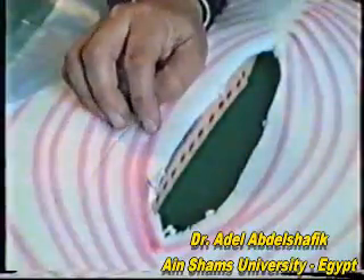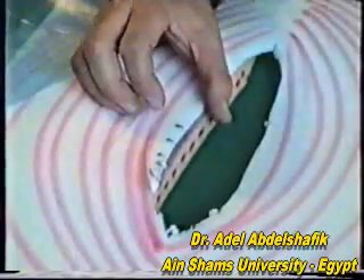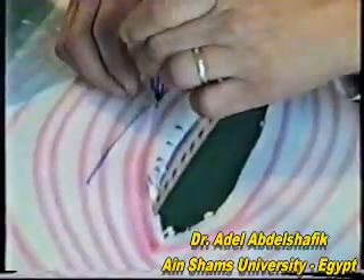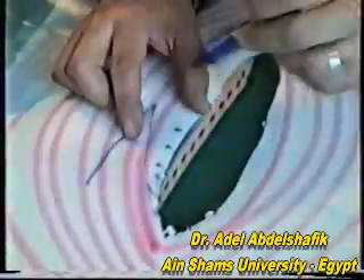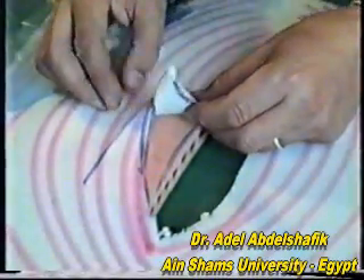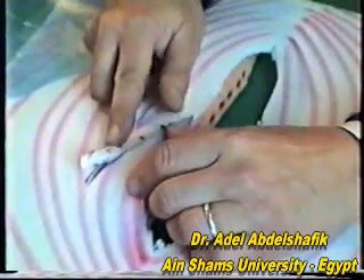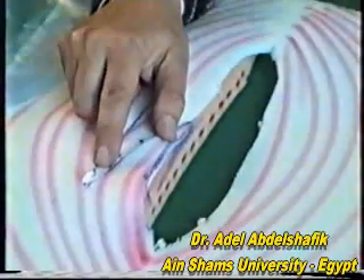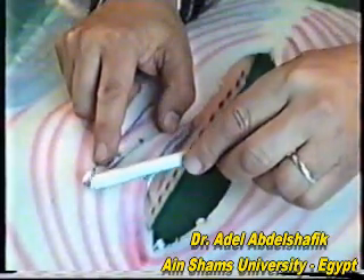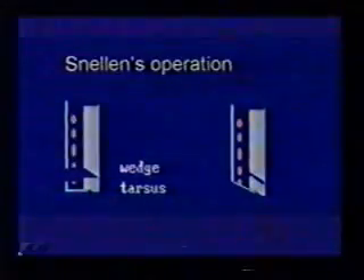The lashes are here before surgery. After replacing the two triangles, you can see where the lashes will be — moved away from the lid margin. This is the final result of Z-plasty for rubbing lashes.